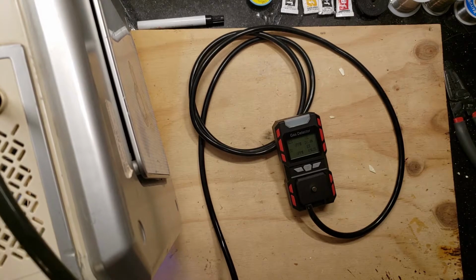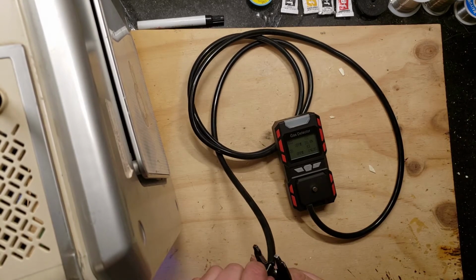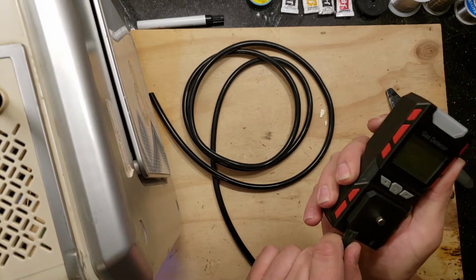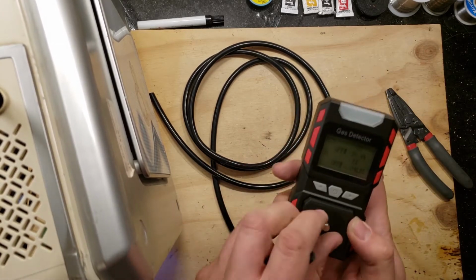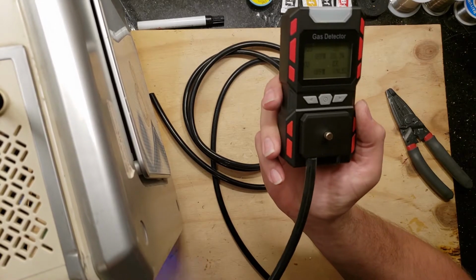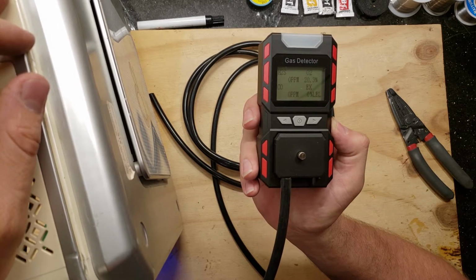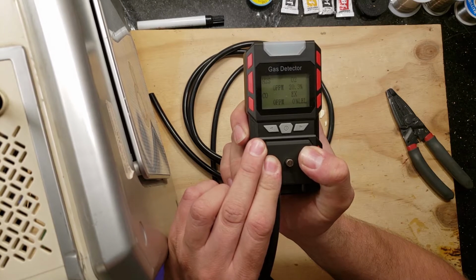Maybe I need to trim this hose a little bit. It's probably pumping too slow through this entire length. So I think I'm gonna do this. Is it pumping? It's pumping. Okay, let's see what we get. It looks like we are getting a whole lot of nothing.